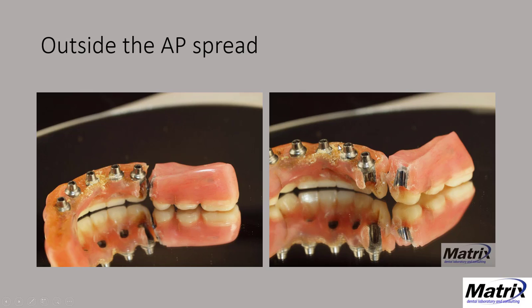But you can see that there was quite a bit of collection underneath because there was a concavity between each one of these. I would have rounded these out and asked to, but there was some concern about food, which is kind of foolish, but food trapping and so forth. So, you know, I just move along, take a look at this up close, and I let my clinical partner know that the last abutment has sheared on the cylinder, and that I would recommend a complete rework, new bar, so on and so forth, and they weren't interested. So I try to document everything as I go along and took pictures of this just to show the difference in the spread and how far it exceeded and where it broke.